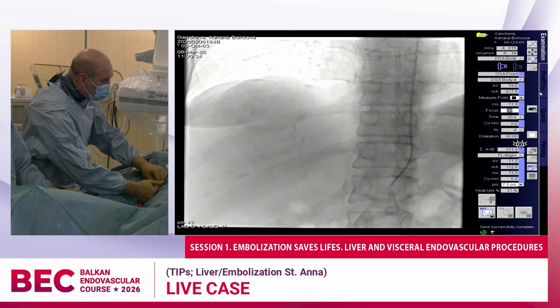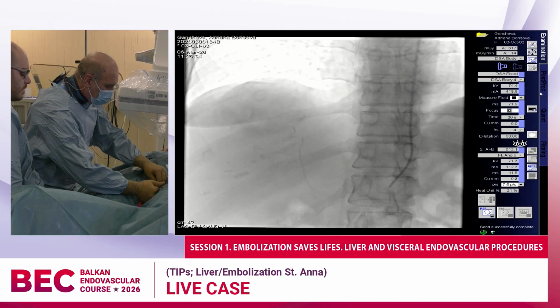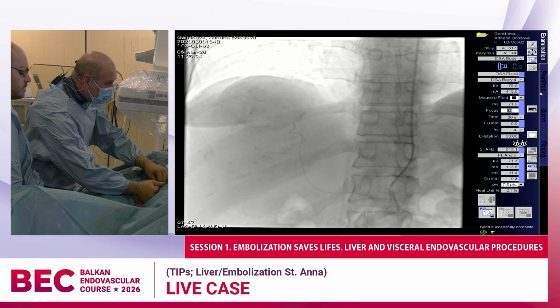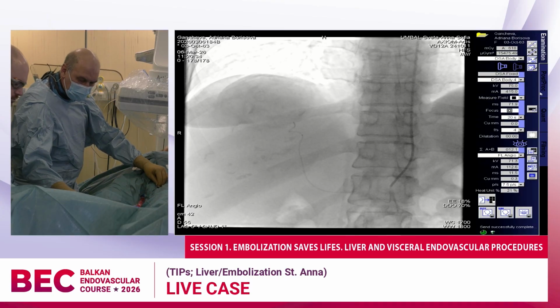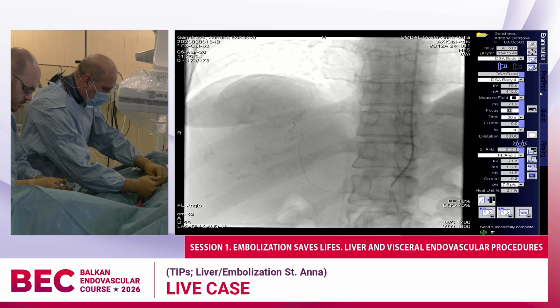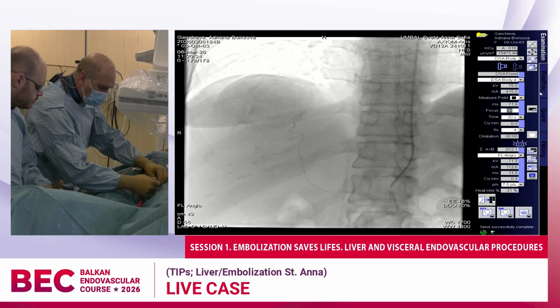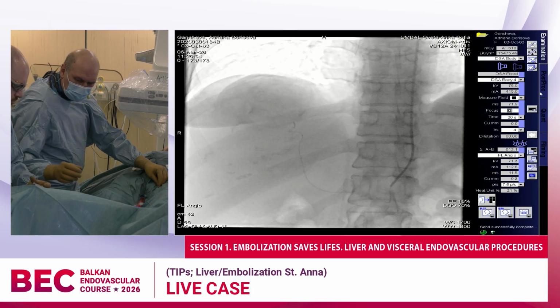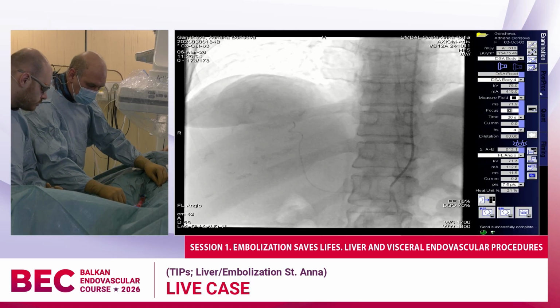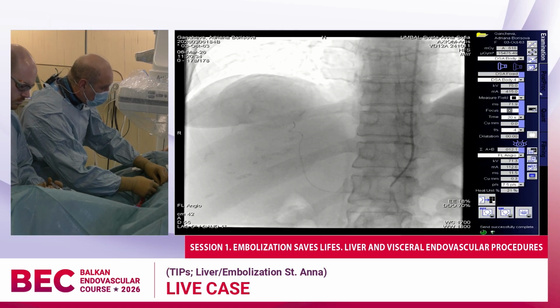It goes relatively easy, even with a 2.4 microcatheter. Of course, a bigger microcatheter would be easier. I think we block it, but I'll push some more water to be sure that we don't have gel sponge stuck inside the microcatheter. And now we're checking the results.